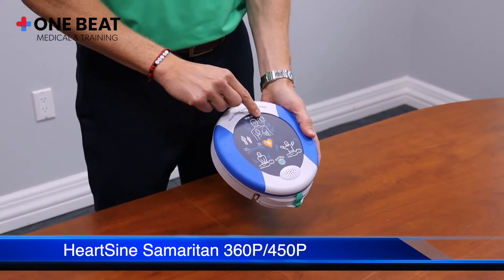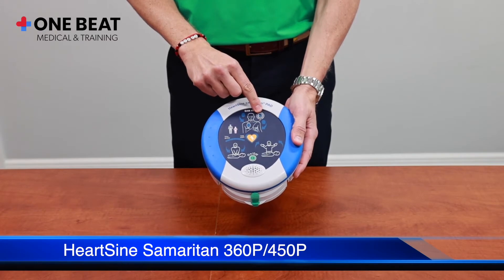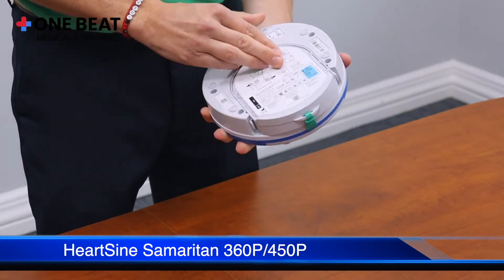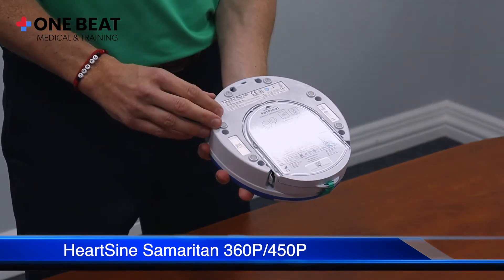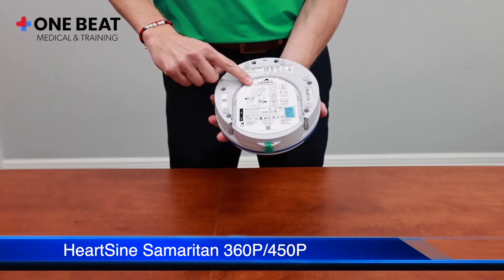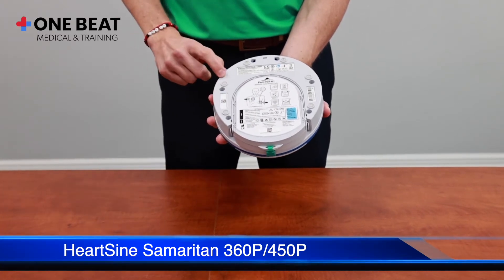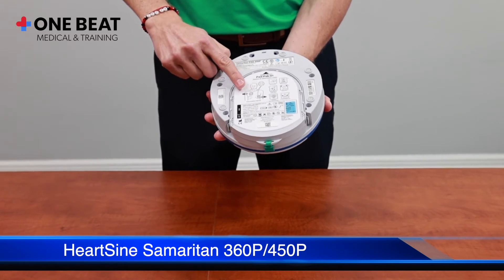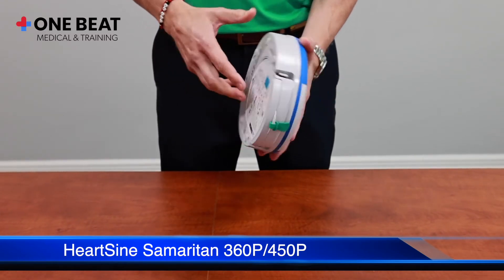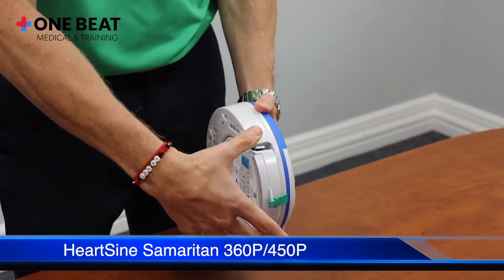On the HeartSine Samaritan 450p, you have a status indicator window that blinks about every five seconds, indicating the machine is ready for use. On the back side, you have a description, the serial number, and the pad pack with the adult image showing pad placement.